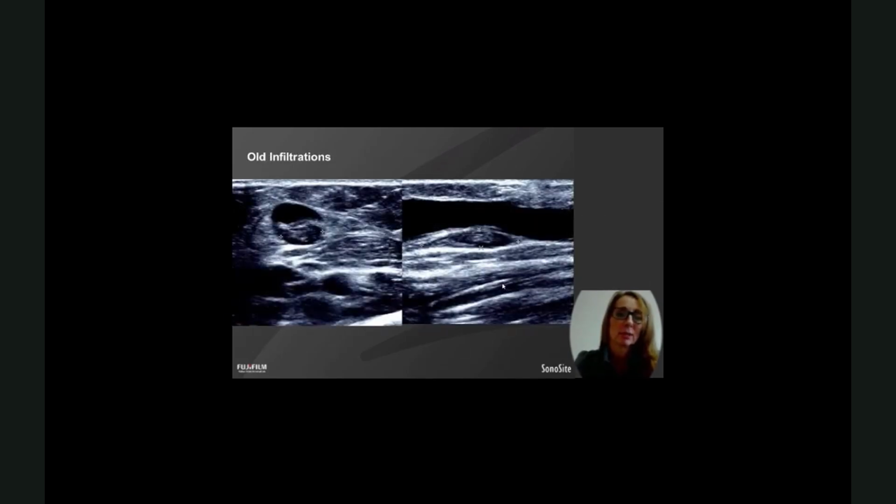Another thing I see a bit of that we don't realise we're doing until we look with ultrasound is that this fistula was a little bit soft and needed really good tourniquet, but it was new, so we were a bit nervous about using too much tourniquet. They've punctured and this is tented down. By the time they've pushed through, they've nicked the back wall, just made a slight little hole in the intima. The blood has filled that intima and reduced the actual lumen size quite dramatically.